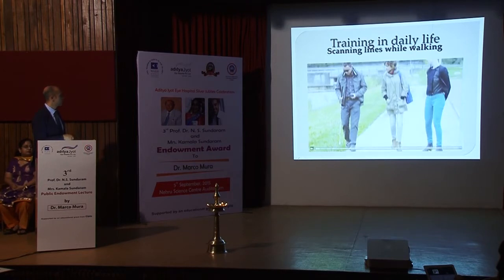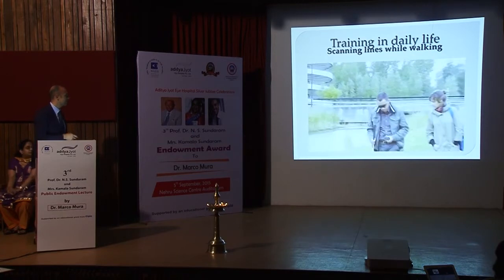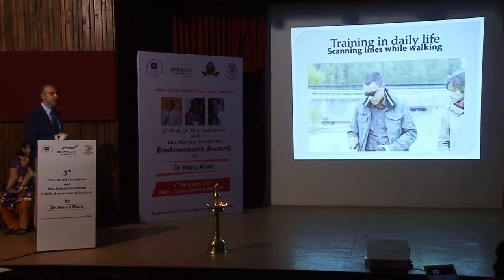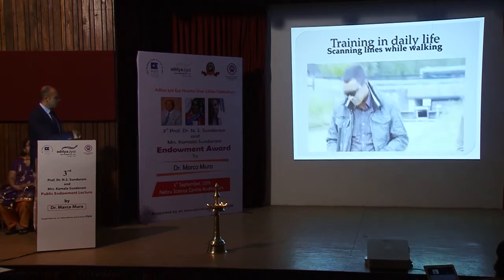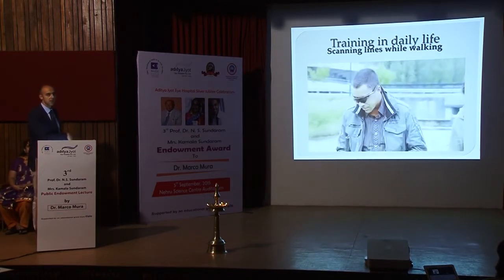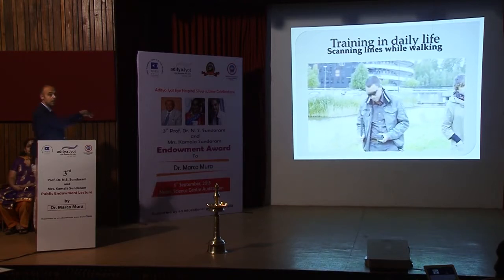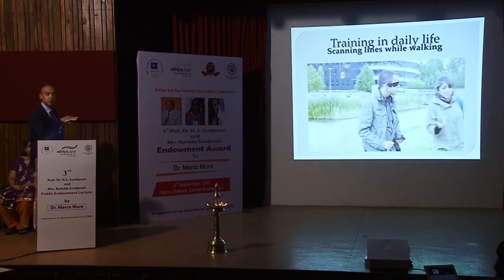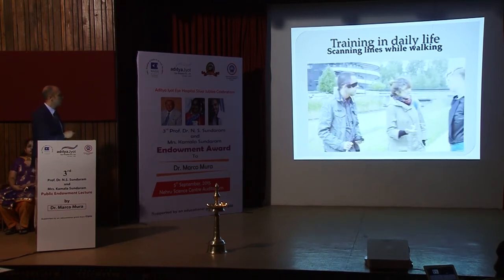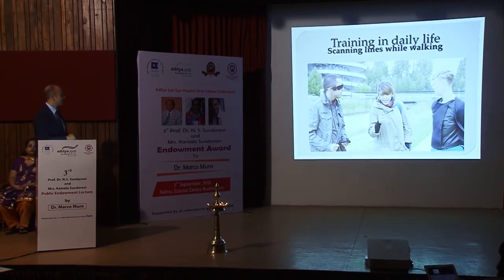And you can see this is one of the patients who is learning to walk only with the stick. And what is really amazing is that they can differentiate the consistency of materials. The patient can tell you that on the right side there is grass, and on the other side it is just concrete, or that there is grass and then there is water, because of the reflection of the image, the difference between grass, concrete, for example, and water. And for young patients, it's really important to be able to do things independently.